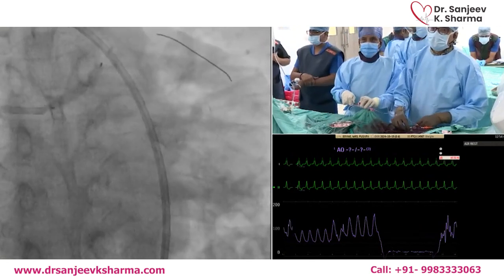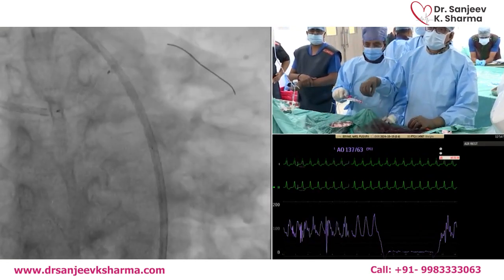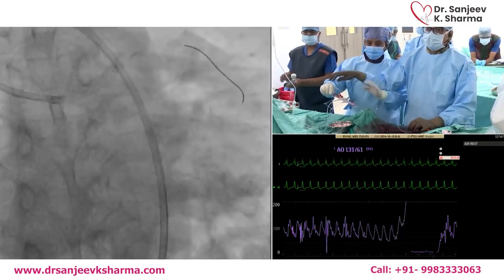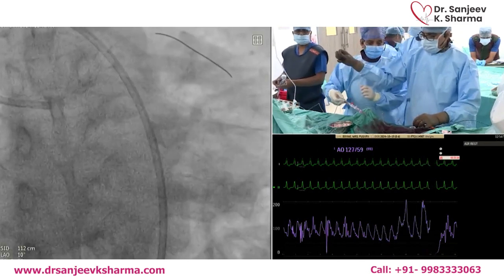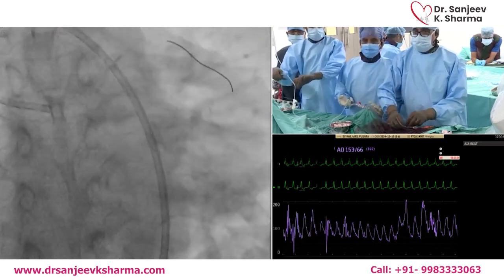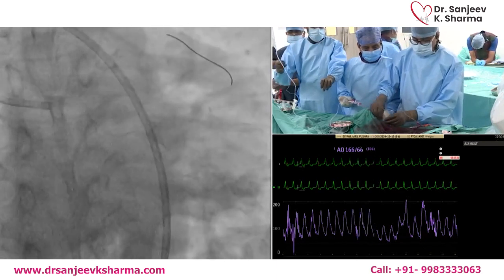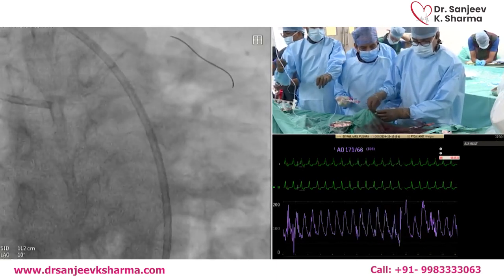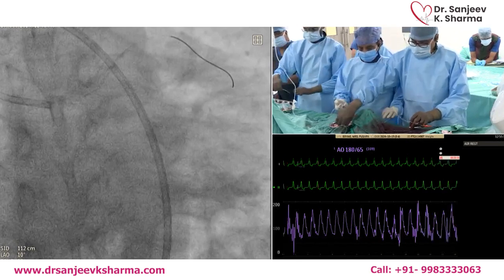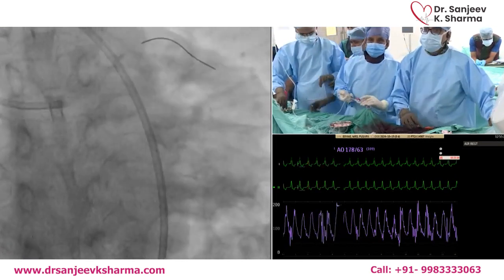So what I will do, if that's okay, because we are behind with the schedule, if the pictures look good, the rest is simple. We are doing a POT and then kiss, and then final imaging. You're okay that we come out and you start getting your lectures? Yeah, I think so, particularly since the next lecture is going to be orbital versus rotational atherectomy, based on case-based learning. I think that's exactly all the questions that we addressed here.